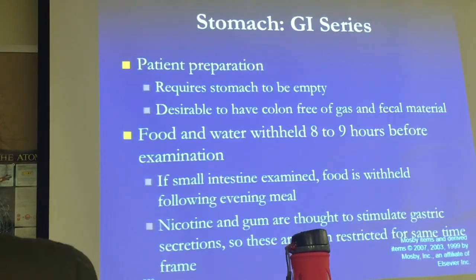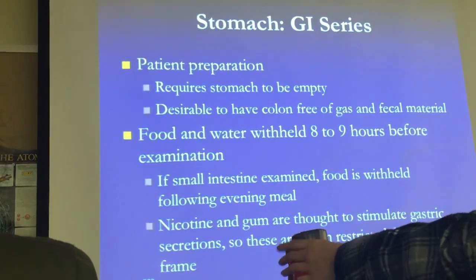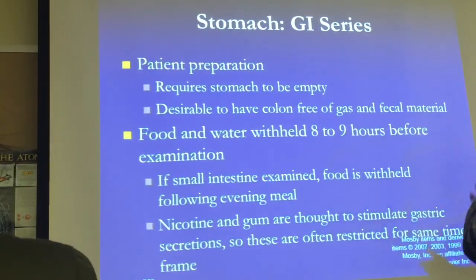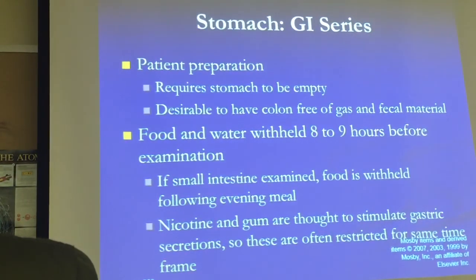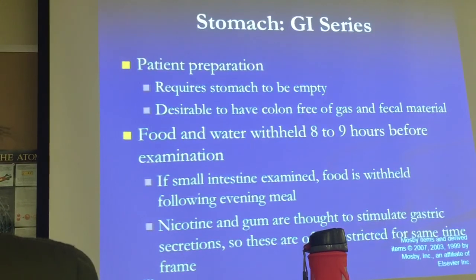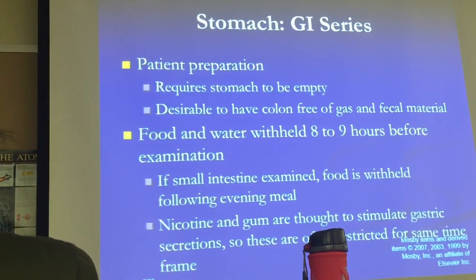Patient preparation requires the stomach to be empty, so no food. A lot of times patients need to take their medication, and it depends on the doctors how they want to handle that. But ideally the stomach should be empty. It's desirable to have the colon free of gas and fecal matter. That's why the KUB is done.